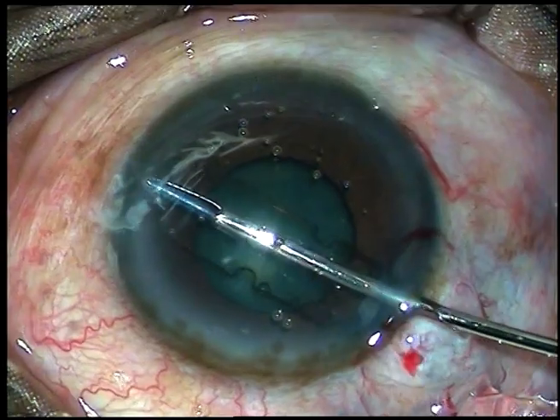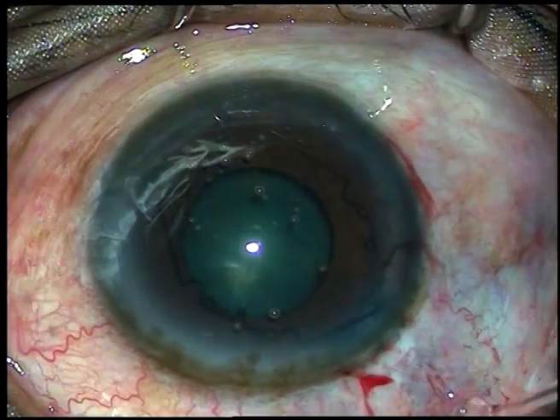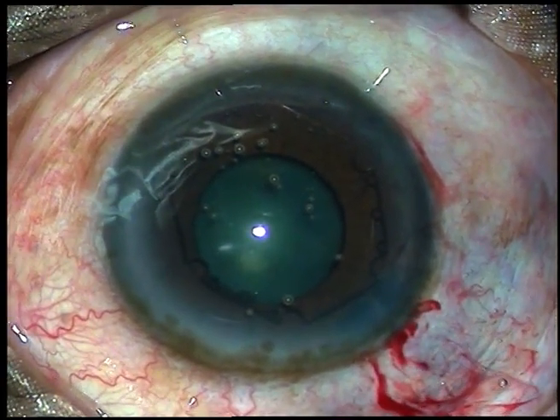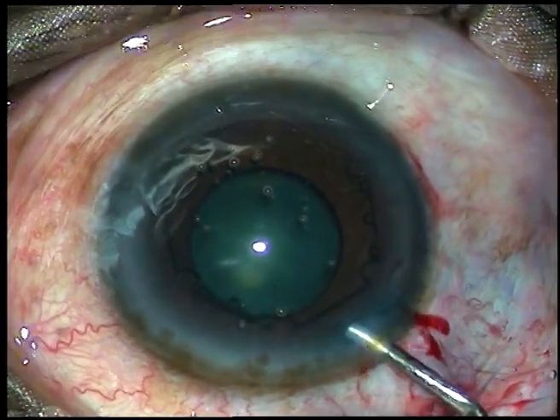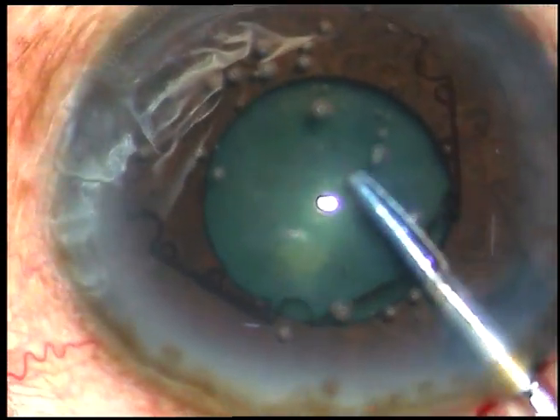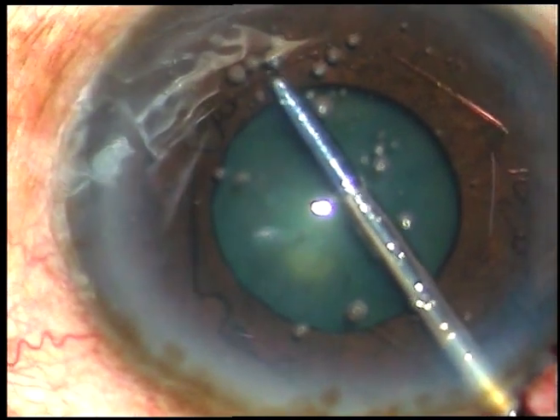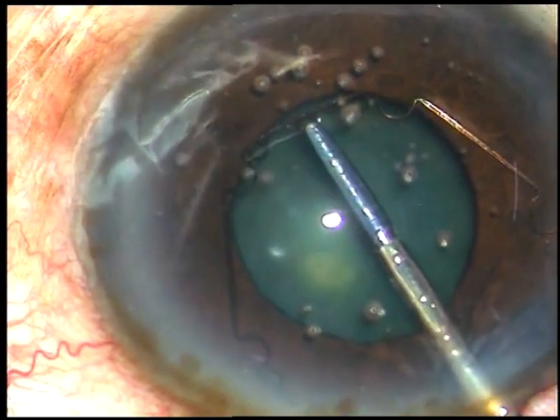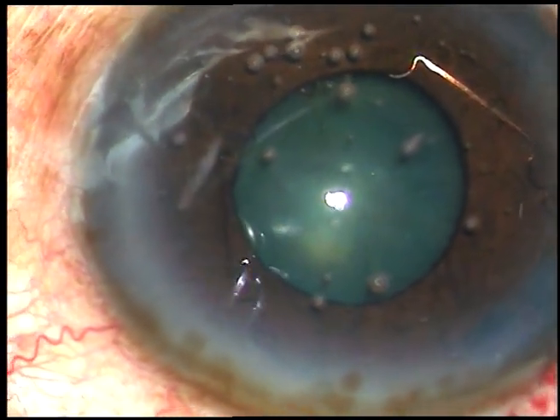This is the second case. See what has happened — the trailing end is tucked in the main incision. If it happens, you cannot tuck the leading flange in one go. So just push the trailing flange into the anterior chamber. Inject some viscoelastic substance. Now use the 23-gauge forceps. Hold the flange which is centered at 5 o'clock and tuck it very gently underneath the iris. It is not at all difficult.